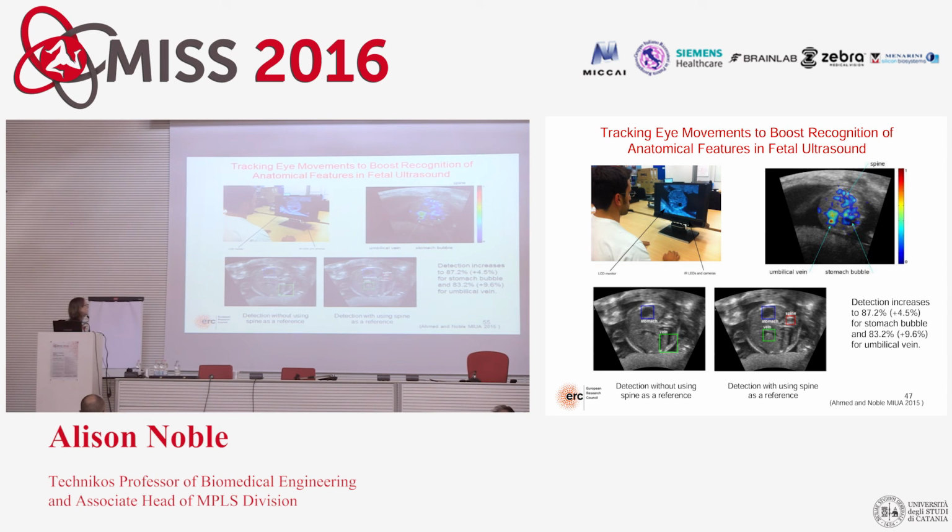So over the last couple of years we've been using eye tracking technology to look at eye movements as we ask them to interpret images. I was most interested to see what features they look at which they're not telling us about. And of course, they said they tell us everything, and of course, we find out from the tracker that that's not true. There are now cheap eye trackers that you can use because it all comes from advancing gaming.